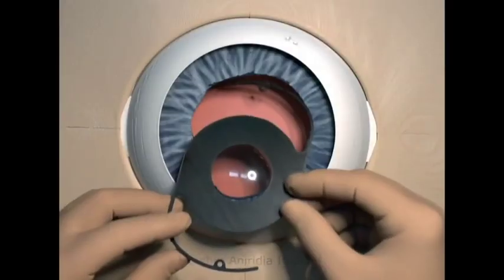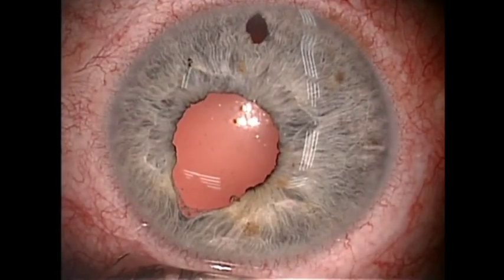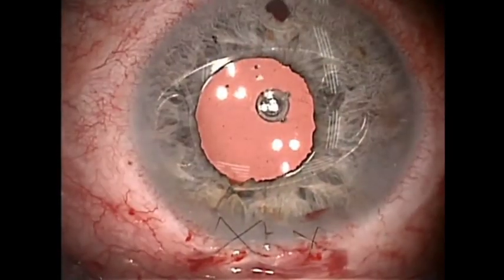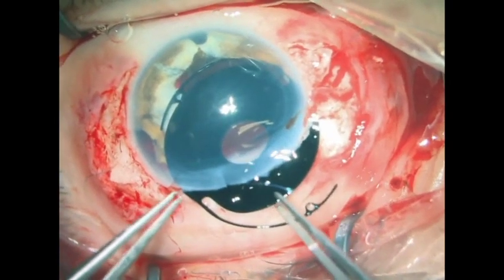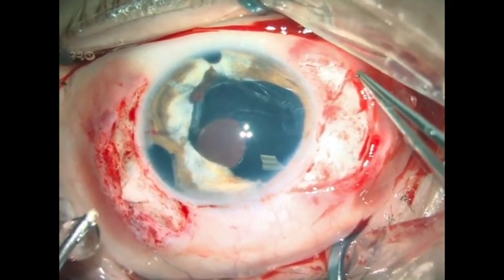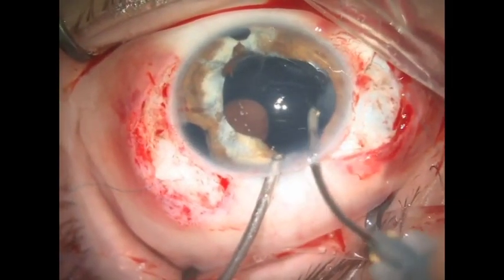For similar cases, Mortar offers lenses with variable diameters of black diaphragm. But we should always consider implanting a standard intraocular lens and suturing the iris. Atrophic and fibrotic iris tissue with several iridodialysis led to the decision to implant an intraocular lens with a wider diaphragm and the smallest available diameter of the optic. Placing the lens is often obstructed by posterior synechiae, fibrotic capsule, and other residues.